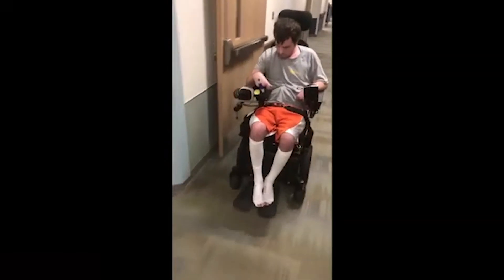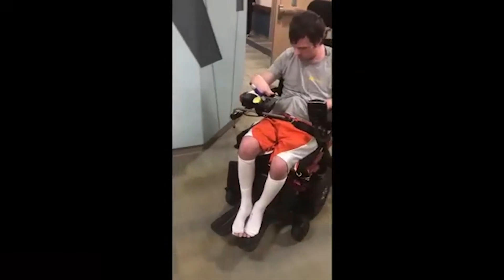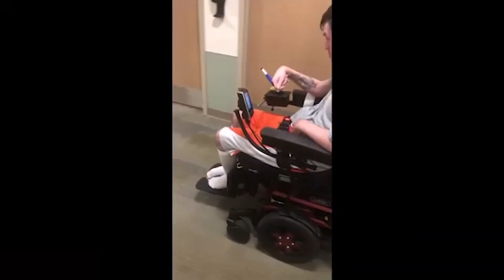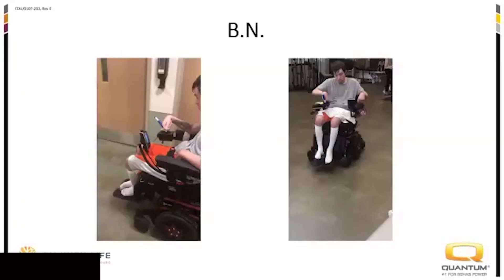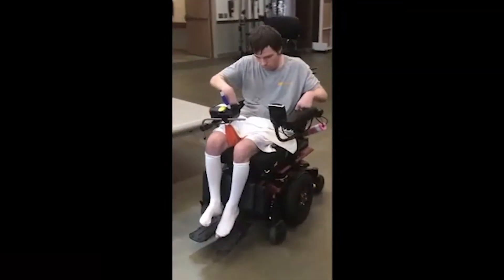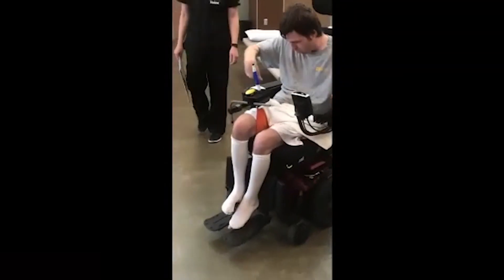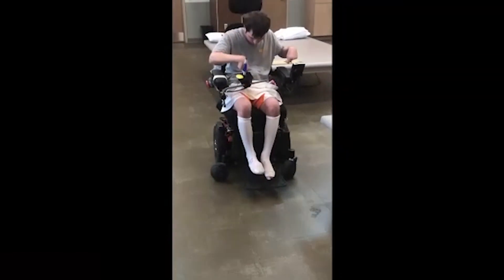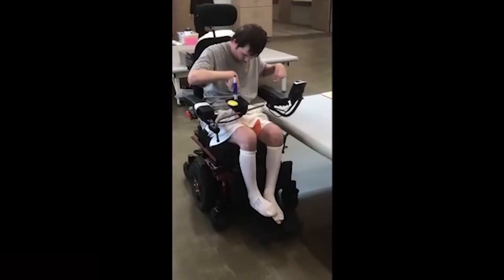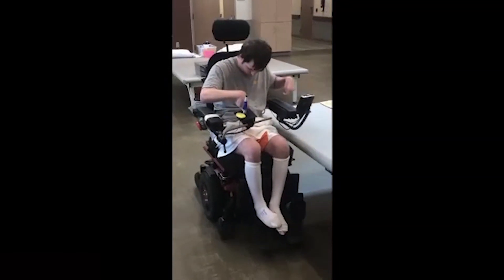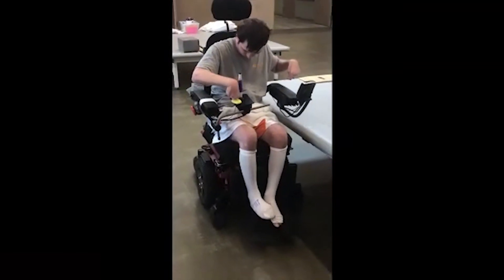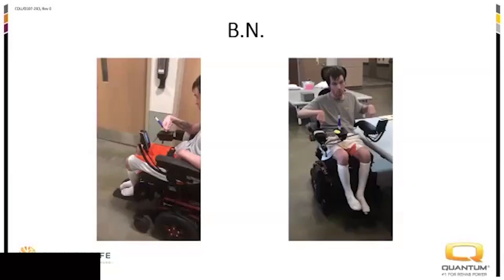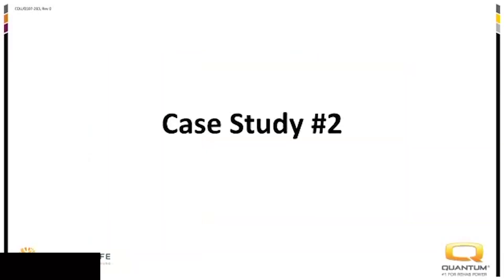Here are a couple quick videos of Brandon. The cameraman is terrible, I'm sorry. But you can see he's driving — he's very efficient, makes turns very well. Here's another one showing him pulling up to the therapy mat, which simulates pulling up next to his bed for preparation for a transfer. He had very accurate control, and you can see him activating the switch.